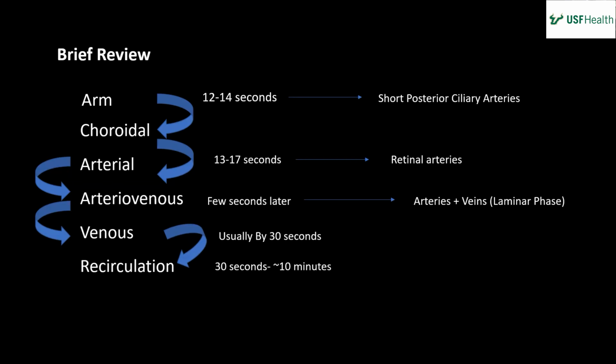You have to wait for the flash to recharge. They use huge capacitors to generate charge to do the flash.